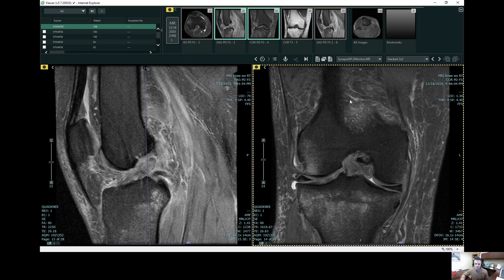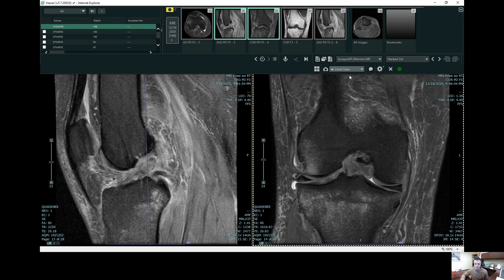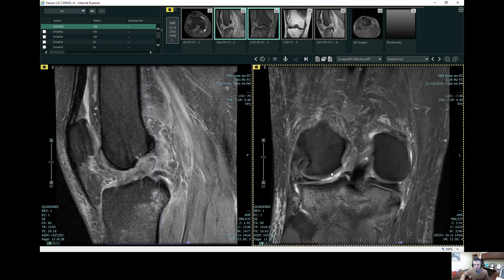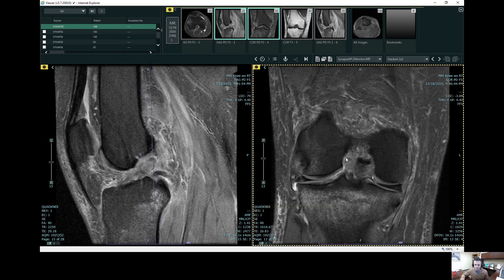Now we're looking from front to back. This is superior towards the patient's head, inferior towards the patient's feet. This is medial — the inside of the knee. This is lateral, towards the outside of the patient's knee. And again, we can see that full thickness ACL tear here.